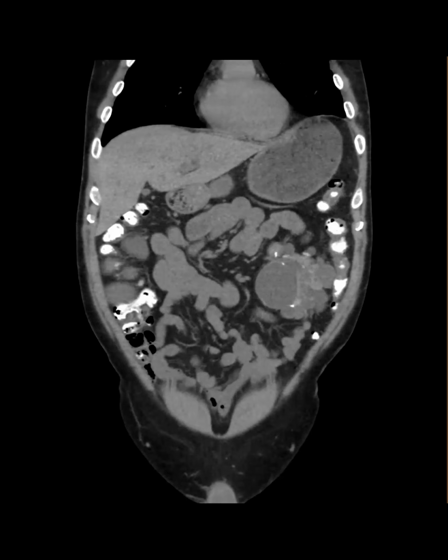Very cool. I always feel a little uncomfortable with these non-cons with polycystic kidney disease and all these lesions. Shouldn't we be evaluating them more? But yeah.